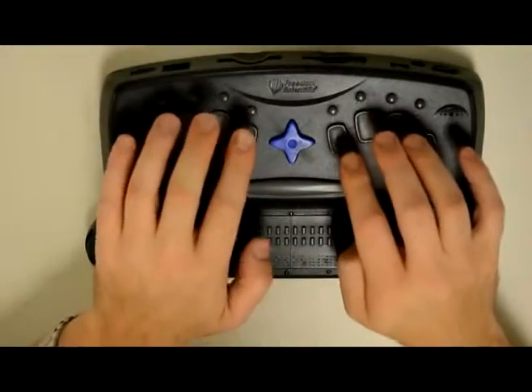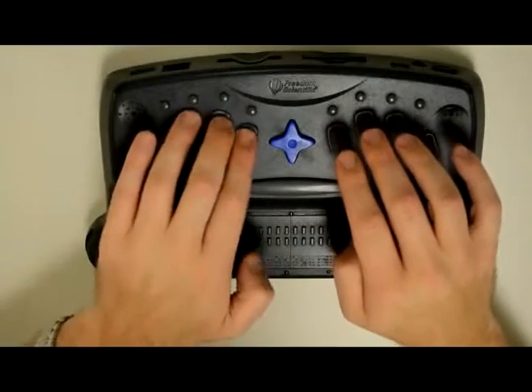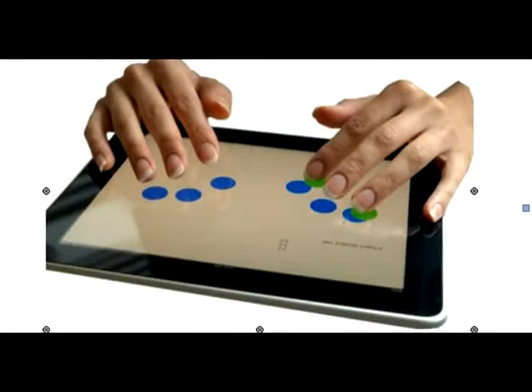B-R-A-I-L-L-E. Previously, researchers at Georgia Tech adapted the Perkins Braille keyboard to touch screens. We've implemented a soft Braille keyboard on the Android platform, working as the main system keyboard.